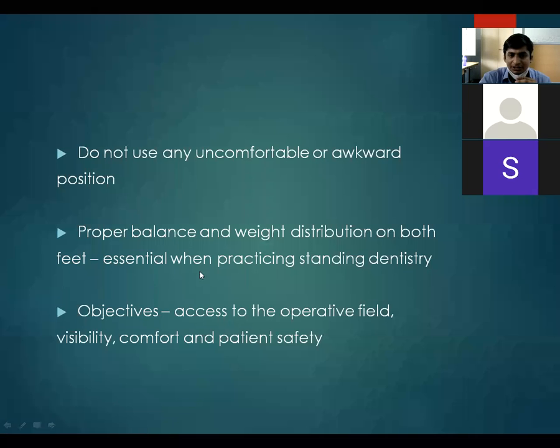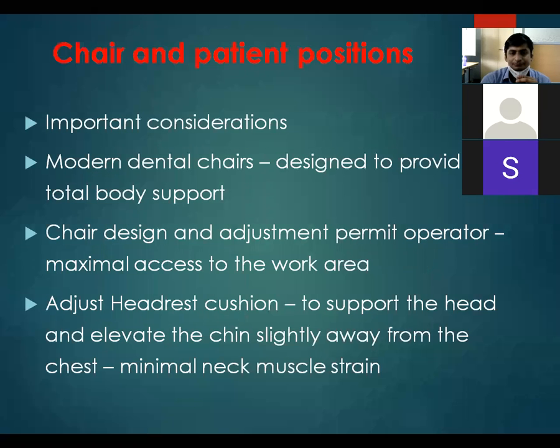So these are the objectives of the proper chair position, proper patient position, proper operator position. What are the objectives? Proper access to the operative field. Suppose you are performing a root canal treatment on your lower second molar. Access to the second molar is very important. Visibility of the area is very important. According to your access and visibility, you have to position your patient and yourself so that you get proper access and visibility. At the same time, you get comfort and patient safety.